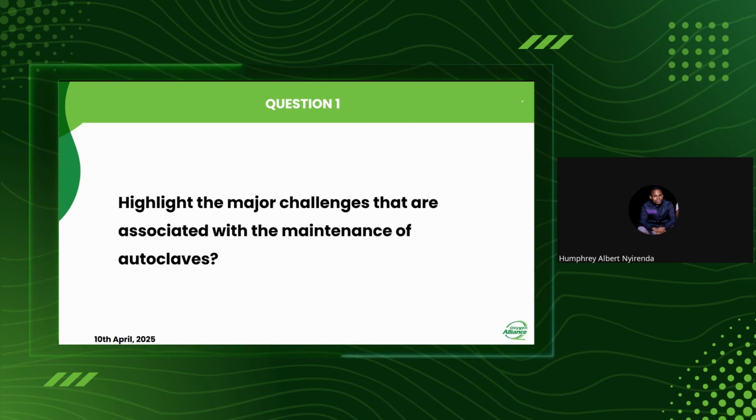But these are the solutions that we can have to mitigate the actual causes of the problem at hand, which are the hardness of water and also power fluctuations. So for the power fluctuations, we would use voltage stabilizers. You can opt to connect your autoclave through the voltage stabilizer so that you sustain a continuous and undisturbed power supply to the machine at hand.